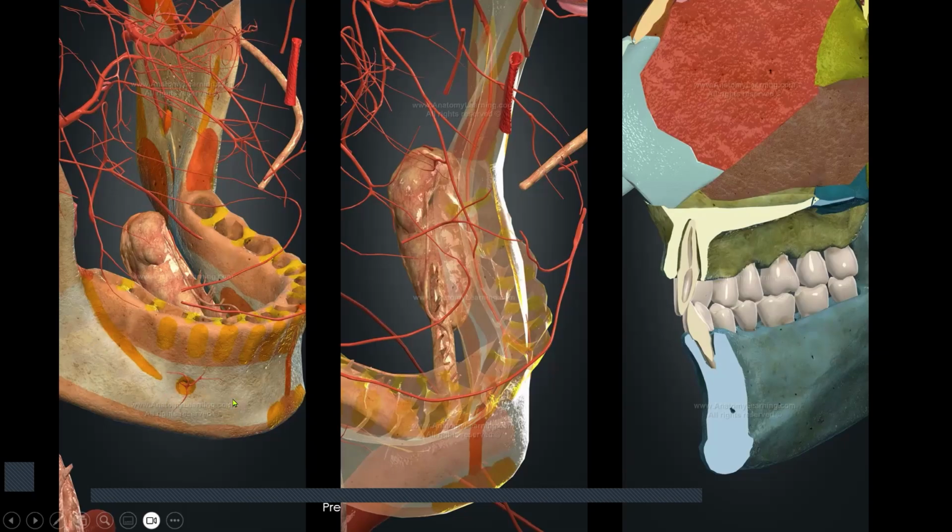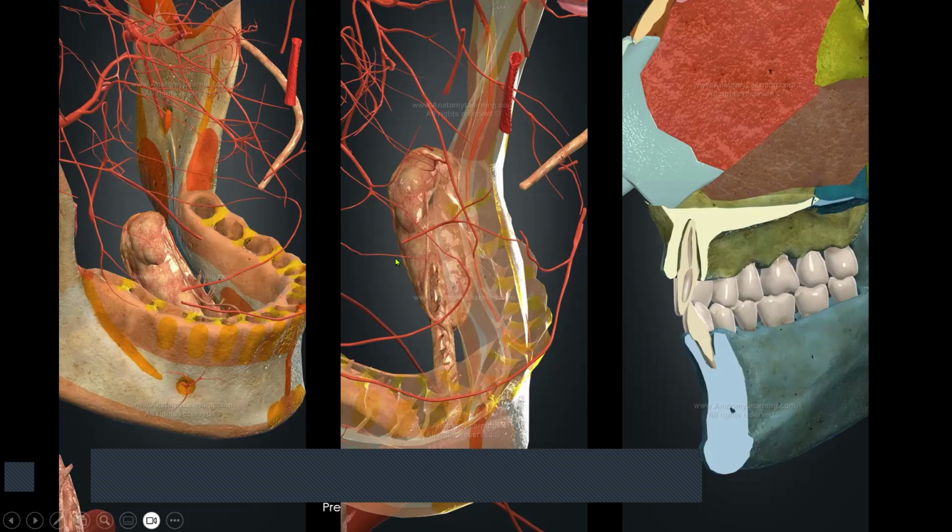Now anteriorly we have said we have to go in the interforaminal region, that too into the center of the bone. Posteriorly, at which location will we place the implant? Posteriorly, if you can see, this is the external oblique ridge on the buccal side, and this is the mylohyoid ridge in this picture on the lingual side. Both of these sides are cortical in the mandibular posterior region.